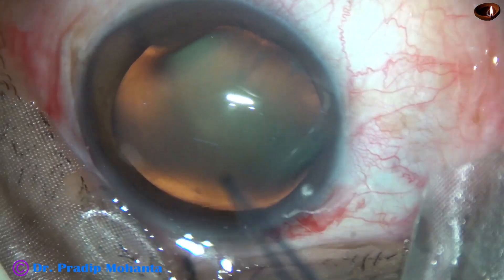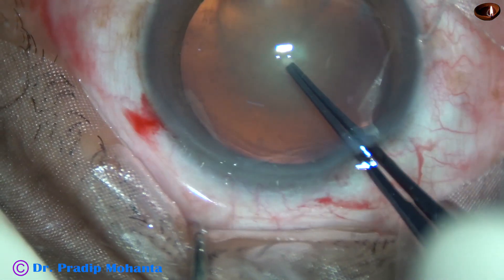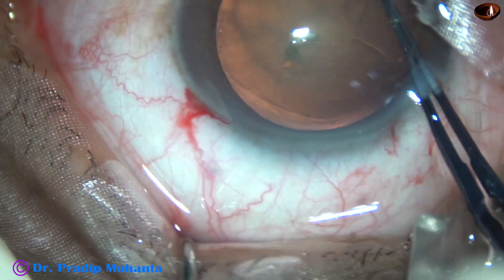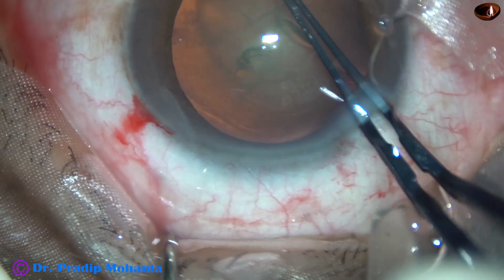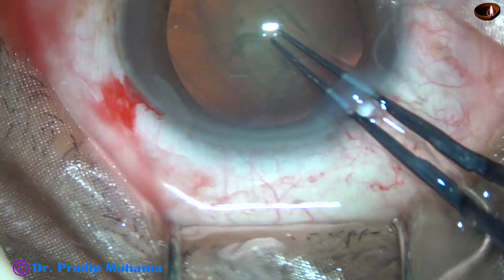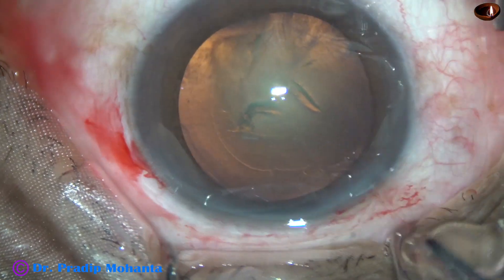And now, I am going to do capsulorhexis using these utrata forceps. The anterior capsule is torn, a capsular tag is raised, and this capsular tag is guided anti-clockwise to do a continuous curvilinear capsulorhexis of about 5.25 mm.